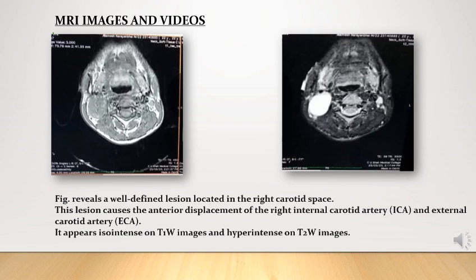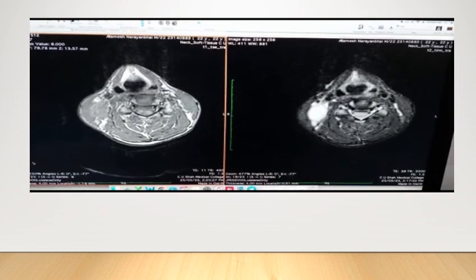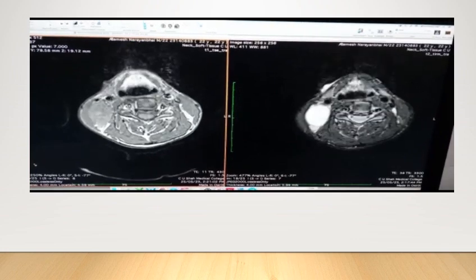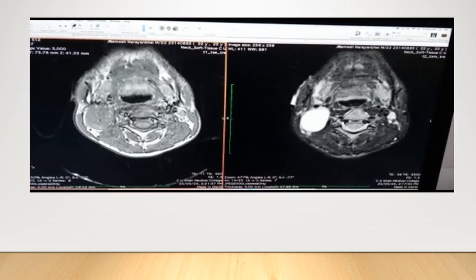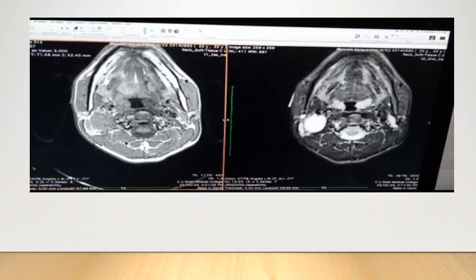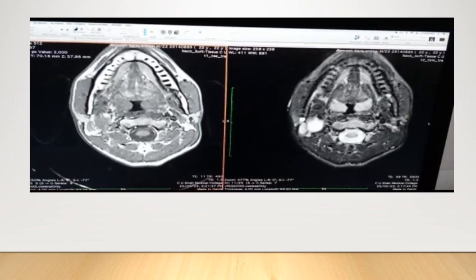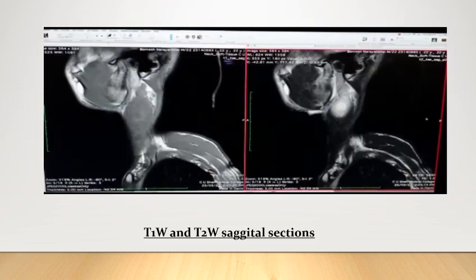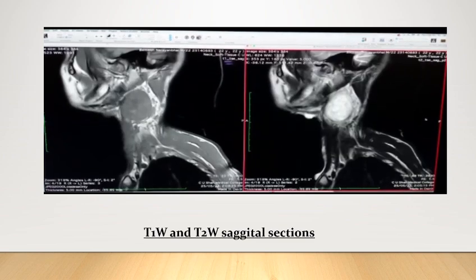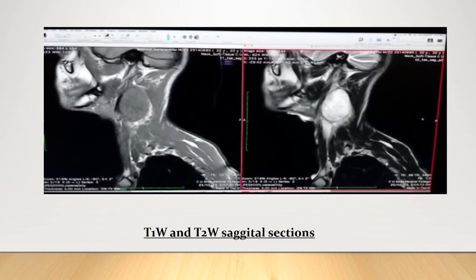The lesion appears iso-intense on T1-weighted images and hyper-intense on T2-weighted images. In the video, you can see a well-defined lesion located in the right carotid space causing anterior displacement of the right internal carotid and external carotid artery. Sagittal T1 and T2-weighted images show a well-defined lesion in the right carotid space.